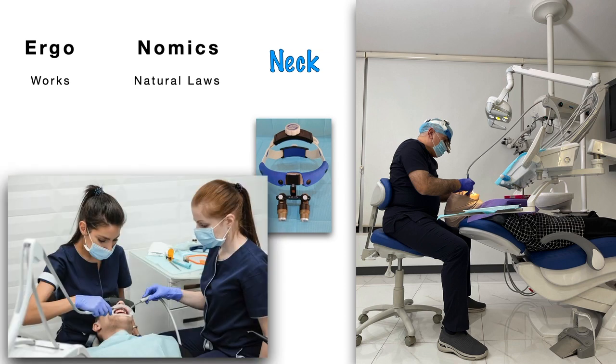Unfortunately, I found some pictures on the net. They take snapshots to tell people that they are treating cases without anything. You see, there is no loop. With all my respect to these people, from the scientific viewpoint, in this case they are not able to see inside the patient's mouth. They are just making a general look at the external part of the patient's mouth, or only the anterior teeth.